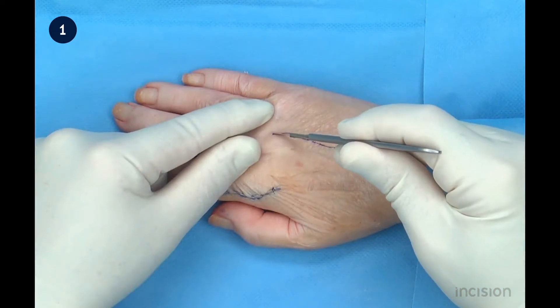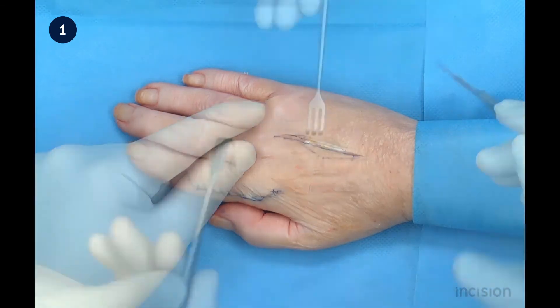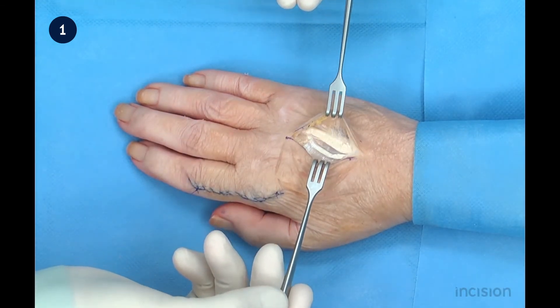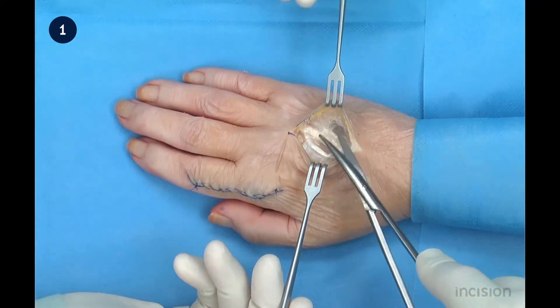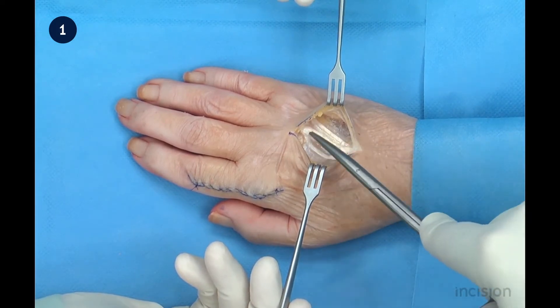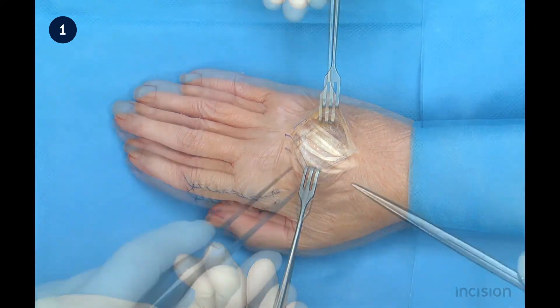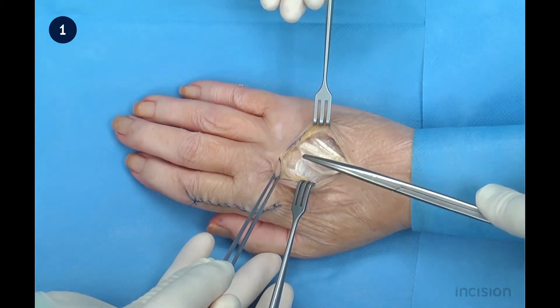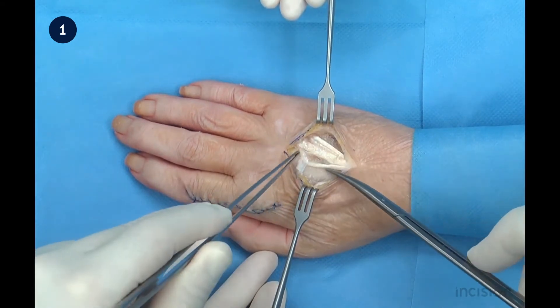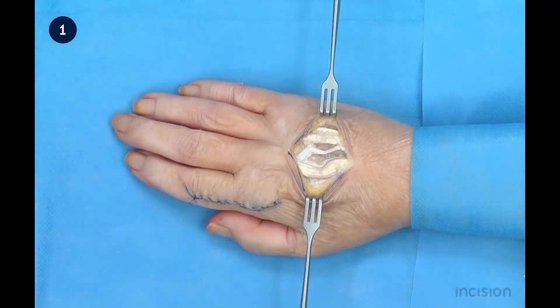The skin is incised in line with the skin markings in a longitudinal direction. The skin flaps are retracted laterally, exposing the underlying tendons. The surrounding subcutaneous tissue is dissected in line with the skin incision, exposing the underlying tendons.